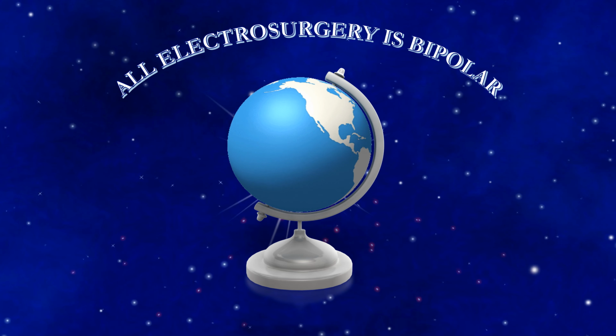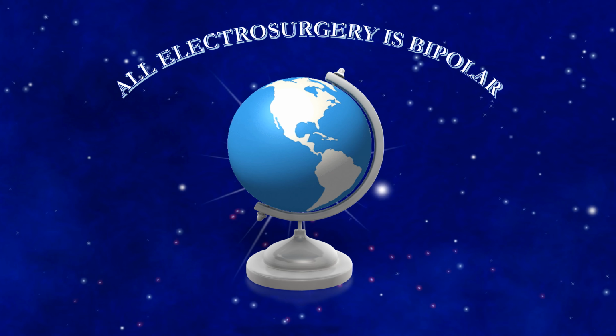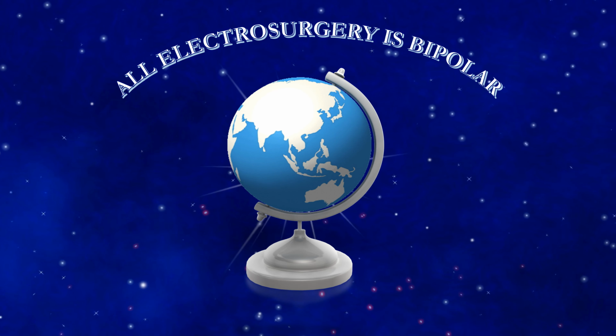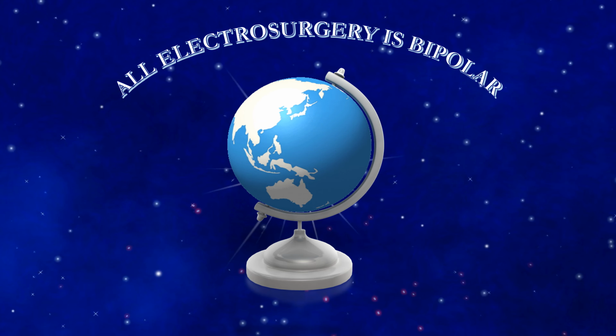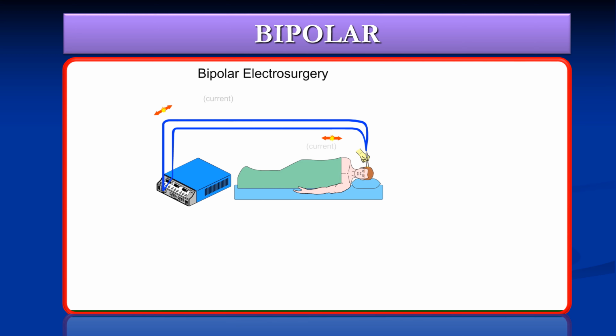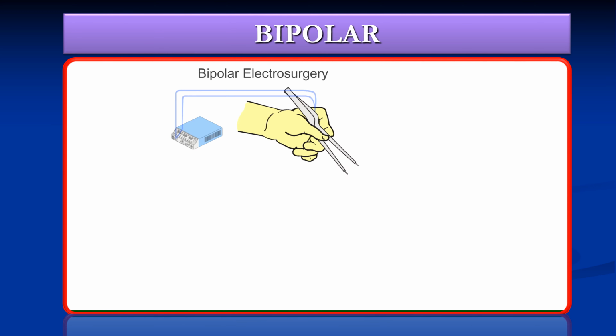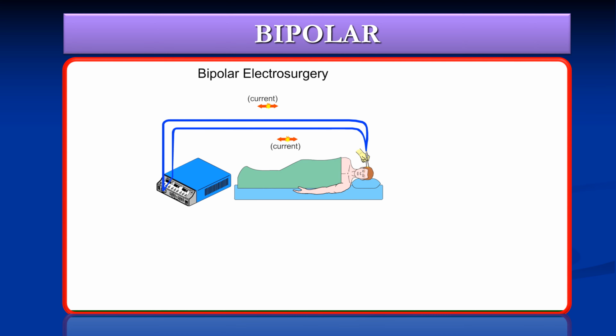Scientifically, we divide electrosurgery into two types, bipolar and monopolar, but remember, all are bipolar. Indeed, conventional bipolar instruments were introduced to overcome the limitations and the complications of the monopolar counterparts.